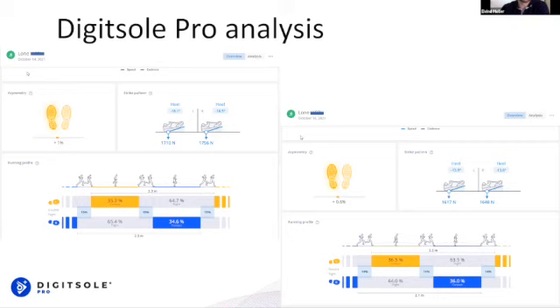So what we saw here gave me some interest in her pattern, and that was the heel impact. She didn't have really massive asymmetry as such, but the strike pattern had a very high heel angle. Her strike pattern was very lifted on the attack angle of her immediate strike to the heel.